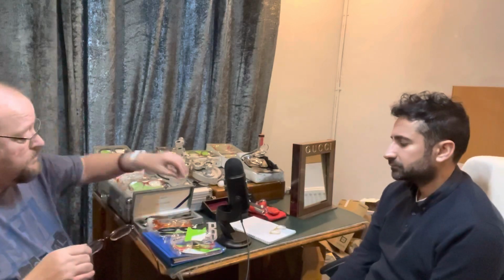So we'll move on to the next frame. This one, a nice sherry colour. Again, I'll just measure this beforehand. So the overall width of the frame, this one is 134 millimeters. So it's less wide than the Shirley, isn't it? The eye size is 50 and the bridge size is quite a wide bridge, and the bridge is 22 millimeters.